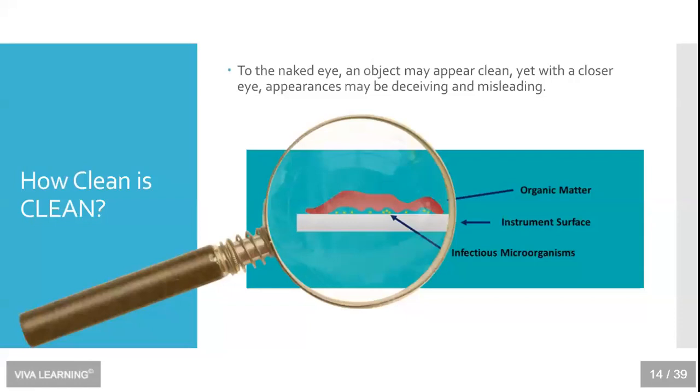If it is not and the instrument goes through the sterilizer, we cannot guarantee that the sterilant, meaning the steam and heat, can penetrate that debris and disinfect and sterilize the instrument surface. So if you have a dental instrument coming out of the autoclave that has crusted on dental materials and such, we cannot consider it sterile. In those situations, it must be re-cleaned and put back through the autoclave one more time. Okay, moving on to the next slide.